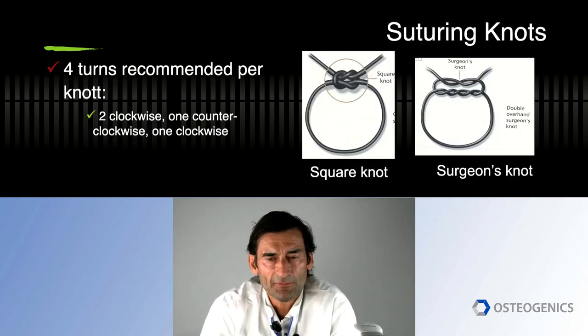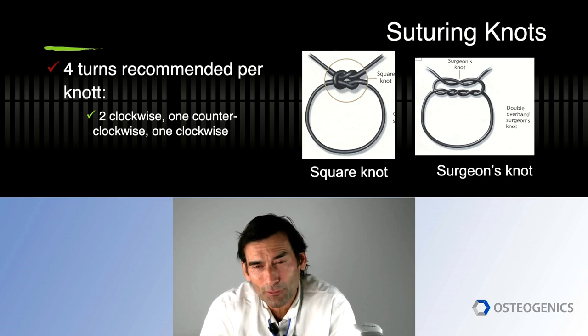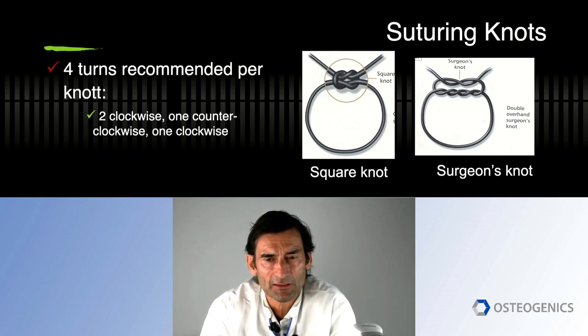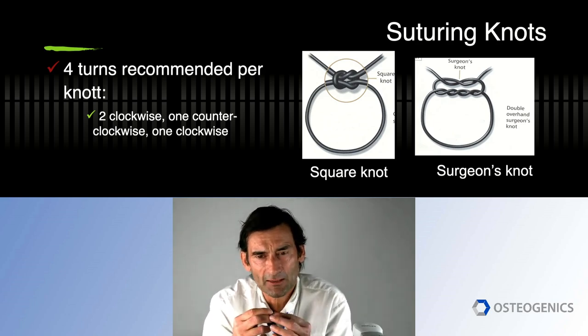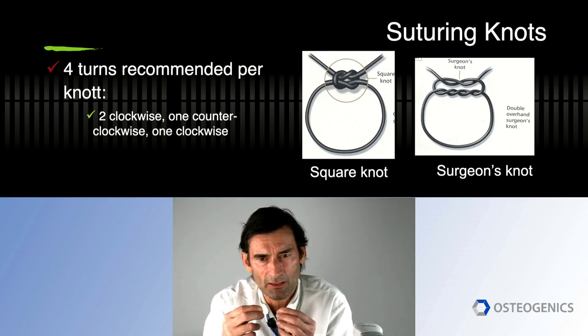Then from a knot standpoint, many questions always come up, like, is 2 knots enough or should I do 3? And I do 4. I started doing 4 knots really traditionally with PTFE sutures, because they have this beauty that at the first knot, when you're tying it, obviously it can loosen a little bit.